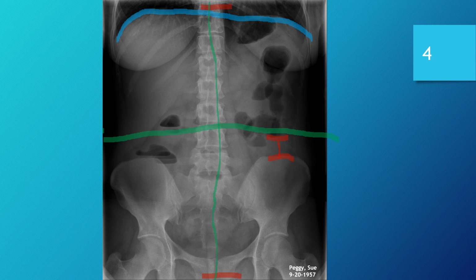I don't see any evidence for rotation. I think there is a little twisting in the patient's spine. That could very well be congenital or pathological over time. I'm not knowing for certain this patient's age. But as far as everything else, it looks to be very well positioned. I don't see any other evidence for rotation or anything of that nature.